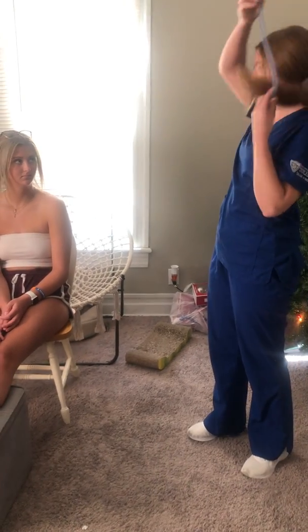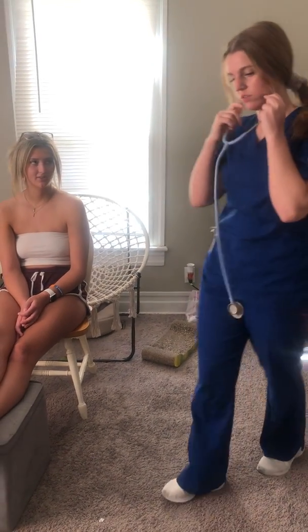Morgan, what is your normal blood pressure? 120/80. Alright, so now I'm going to take her blood pressure.